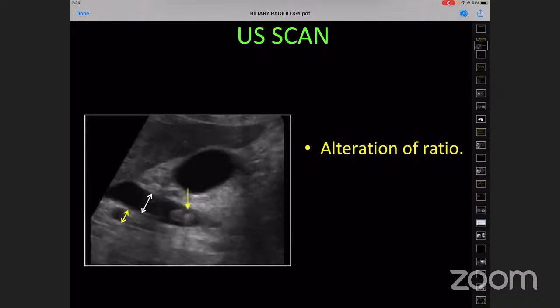are you confident in the diagnosis of pancreatitis if you did not know the lipase report, radiologically? Radiologically, if it is a very mild pancreatitis, you might not have any morphological change in the pancreas. On CT scan, you would only see some streaky peripancreatic densities. The pancreas is more or less normal in size. In that case, it is very difficult to diagnose pancreatitis on ultrasonography, because the morphology of the pancreas would be almost normal, but the patient would definitely have probe tenderness over the pancreas, number one.